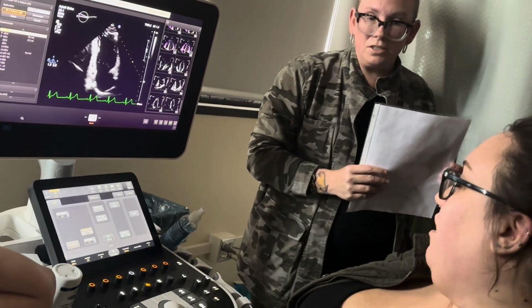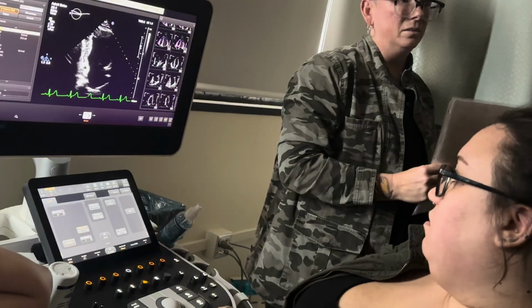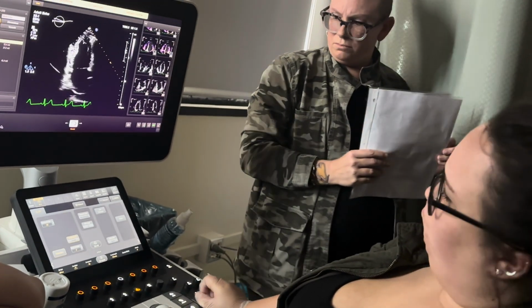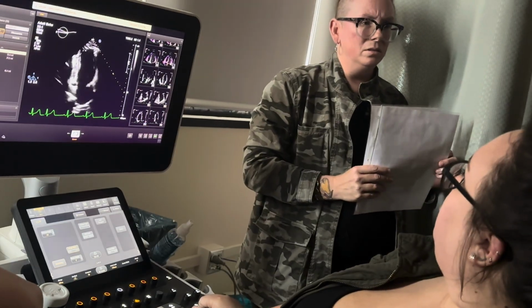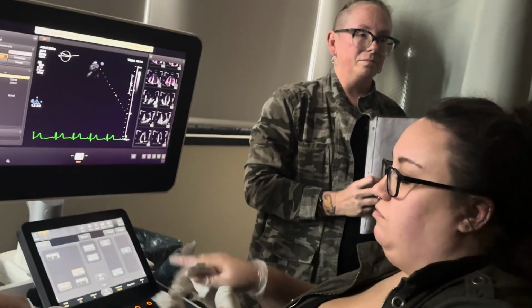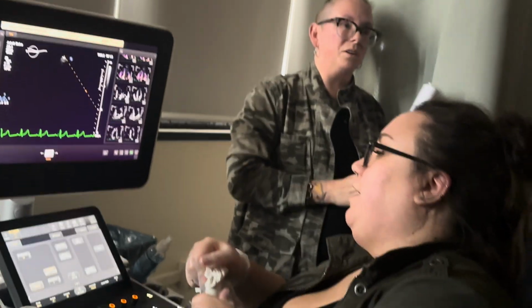I'm just hanging out. I don't know if this matters anymore, but when I was doing my PE, it kept changing from 3 beats to 2 beats. Is there a way to keep it on 3 beats? Were you still on that protocol? I bet she was. You probably were, that was before, like you told me. Okay, because I kept switching it to 2 beats. Yeah, that was probably that protocol thing.